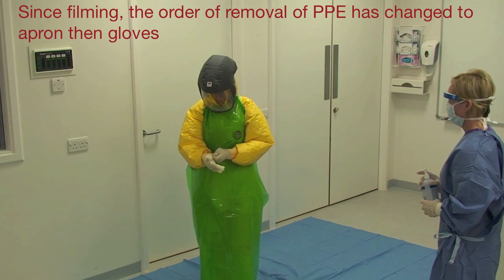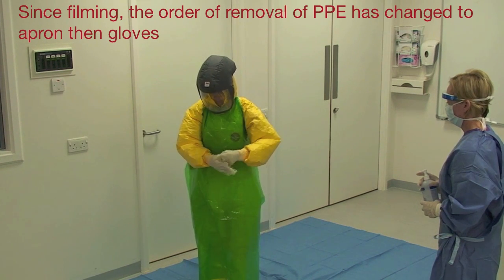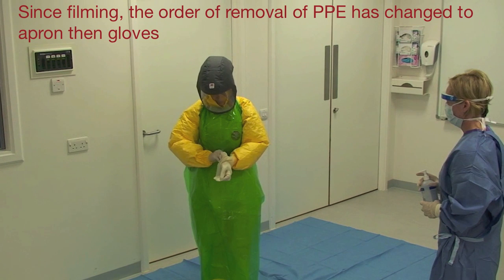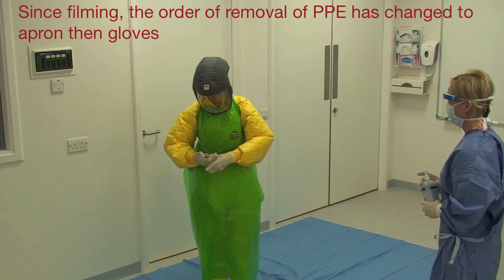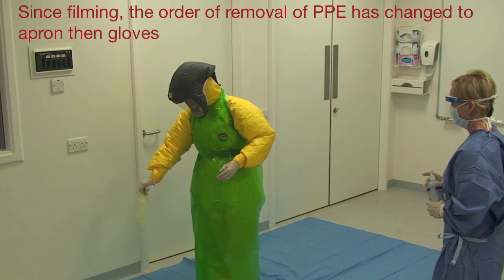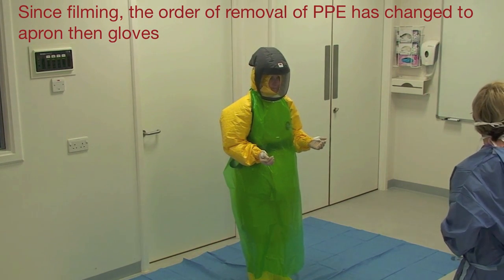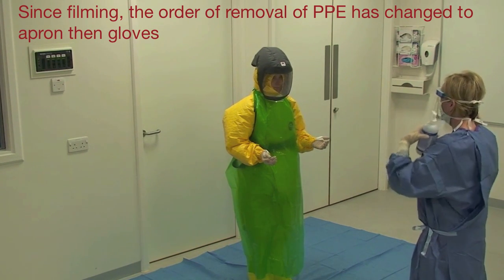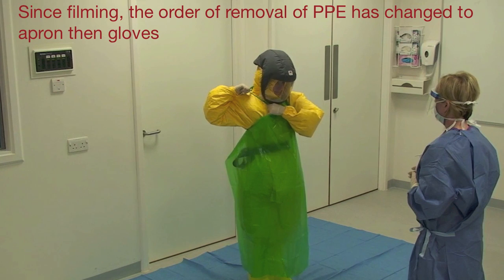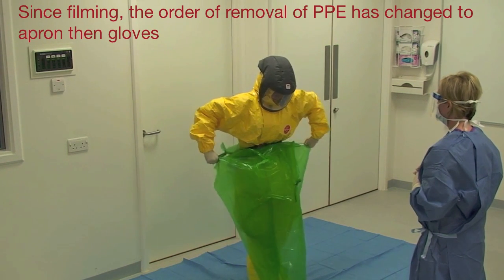The healthcare worker removes their first pair of gloves and places them on the blue sheet. They remove their apron by breaking the neck and waist ties while rolling it into itself, then place it on the blue sheet.